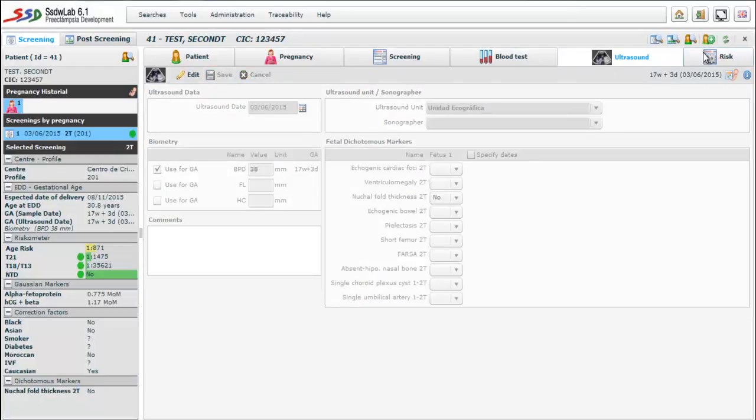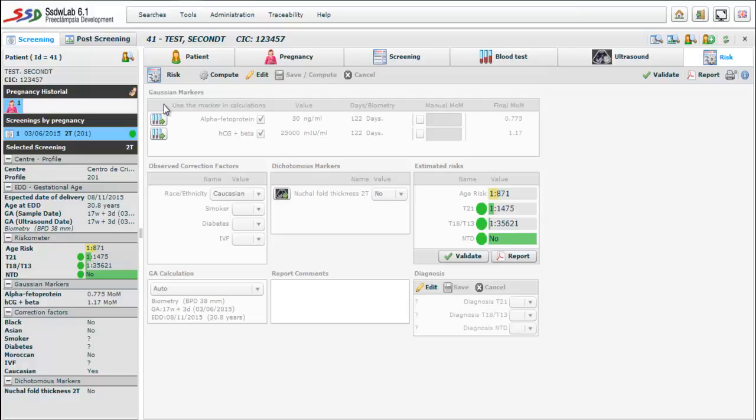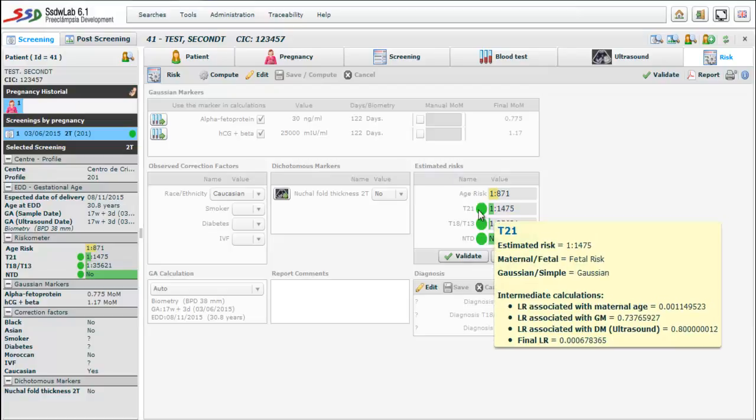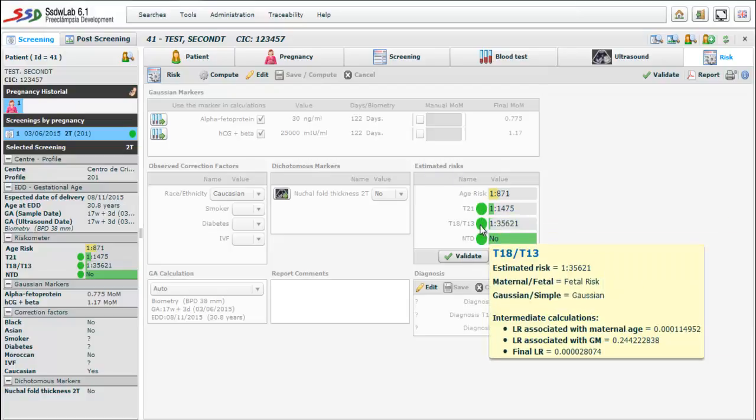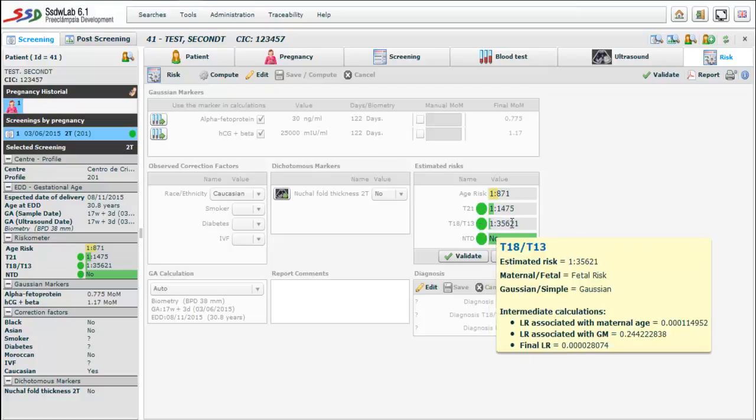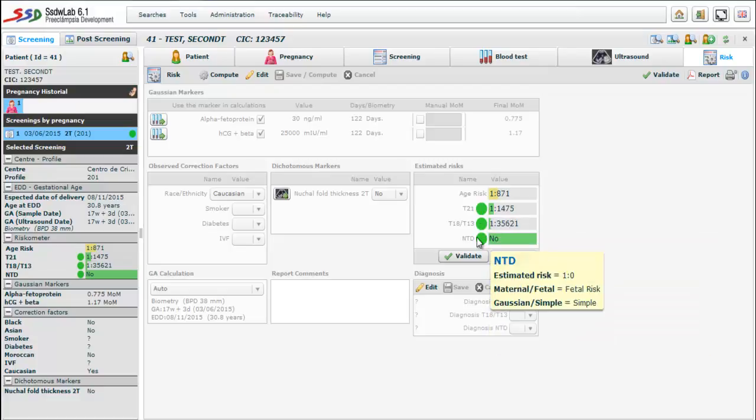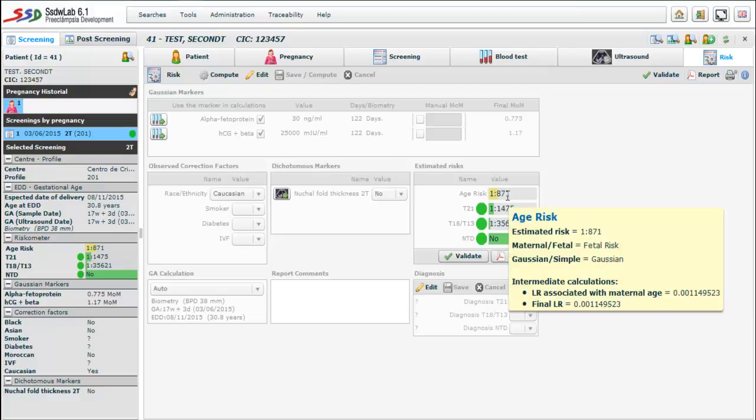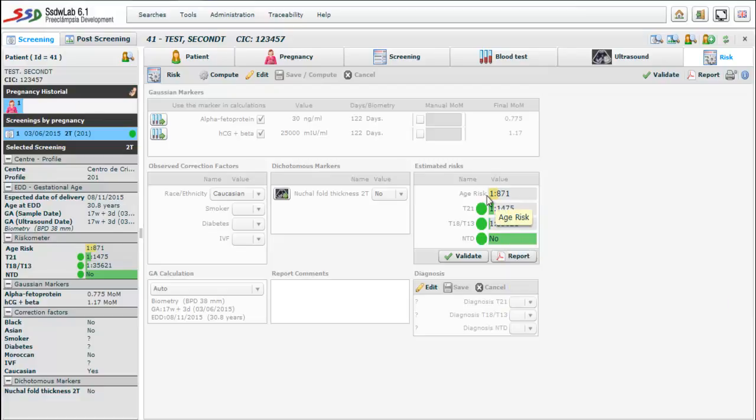Finally we come to the last folder called risk. We find on the top of this folder information about the Gaussian markers used in risk calculations. Thus we see the values of the markers and their respective MOMs. In the middle left we observed correction factors. In the middle center the dichotomous markers measured. And in the middle right we see the estimated risks: maternal age risk, trisomy 21 risk, trisomy 18-13 risk and neural tube defects. These are represented by colored bars. Green when the risk is low, red when the risk is high, and the risk of maternal age is always displayed in yellow.